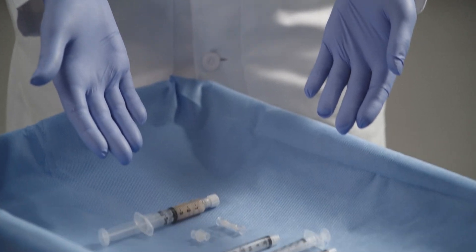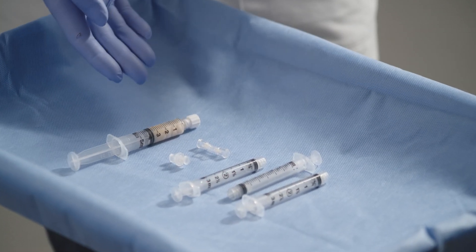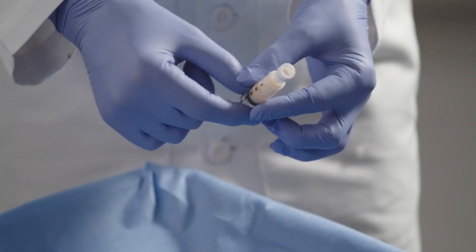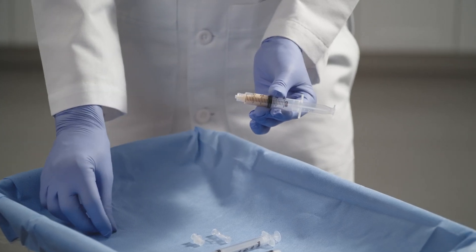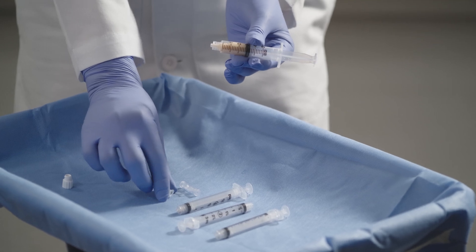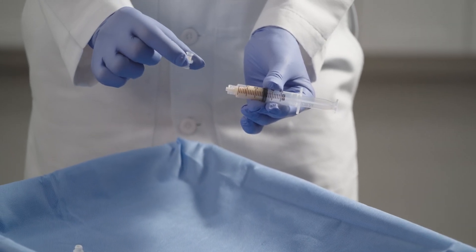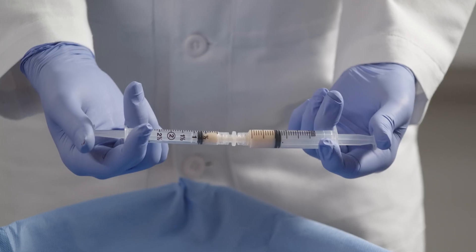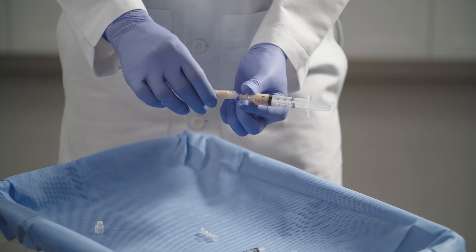These are the components of your Renuva HD 3cc unit and accessory kit. We are first going to take your Renuva unit and, using the standard luer lock connector, allocate about half of the Renuva into two different empty 3cc syringes.